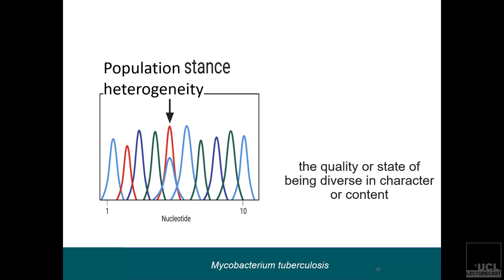This is one of the reasons why we do a line probe assay to confirm the rifampicin resistance alongside the phenotypic tests, because there are instances where a test kit does not have a particular mutation incorporated in it. If that mutation causes resistance, the test will give a negative result for resistance. So we do multiple tests to confirm, and the ultimate one, of course, is phenotypic testing.